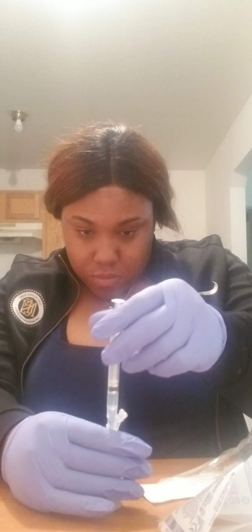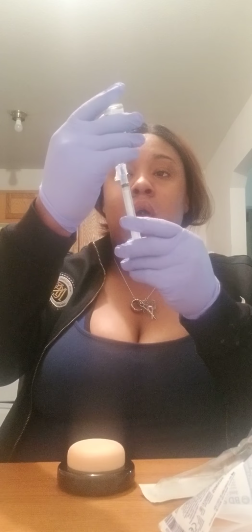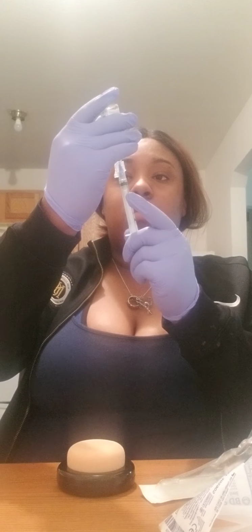Okay, I'm doing 1. Now we're not going to aspirate this, because if we aspirate, we're aspirating for blood. So we're going to get to 1.